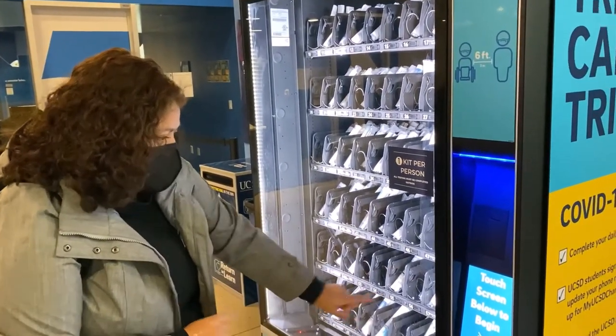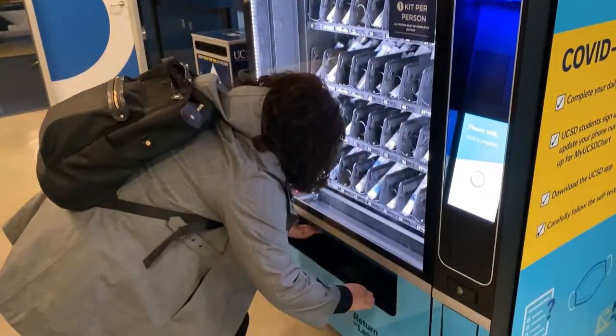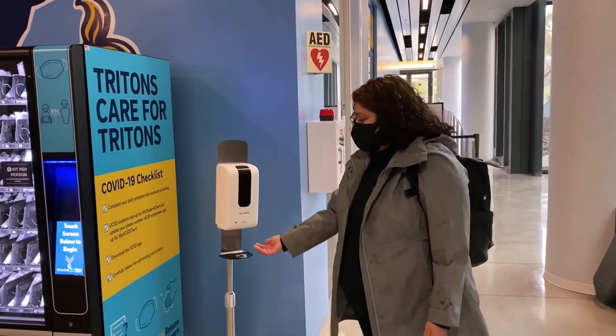I'm going to go with 58. In the future you will need to swipe your UCSD ID to release a kit. And here's my test. You'll want to make sure you sanitize your hands again.